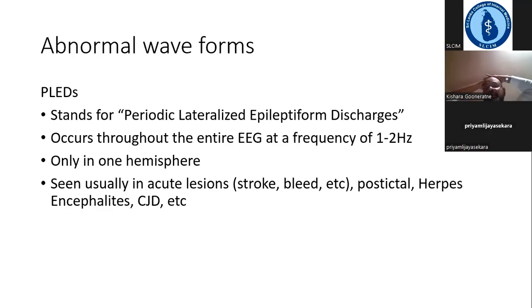They can be seen in structural lesions such as stroke and intracranial hemorrhages, and also as part of a postictal phenomenon. We all know about HSV encephalitis that we look out for, and CJD is another example where we will see these PLEDs.